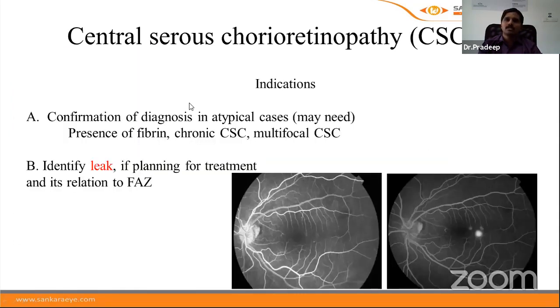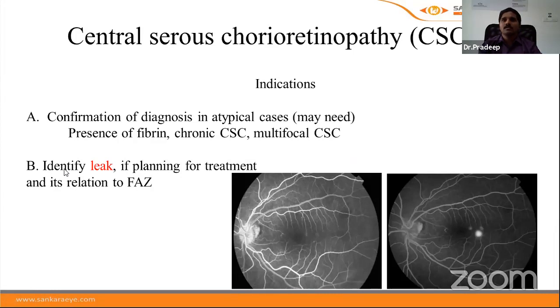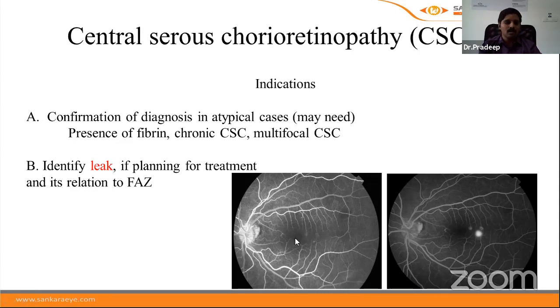Indications for FFA in CSCR include confirming diagnosis in atypical cases such as those with fibrin or multifocal CSCR. The second indication is identifying the leak point for treatment planning — determining its location relative to the foveal avascular zone. If the leak is away from the fovea, focal laser photocoagulation can be performed. If it is in the subfoveal area or very close to the fovea, photodynamic therapy should be considered instead.